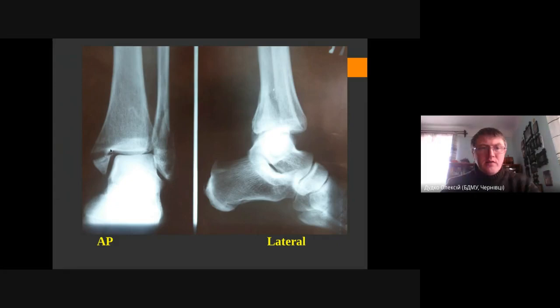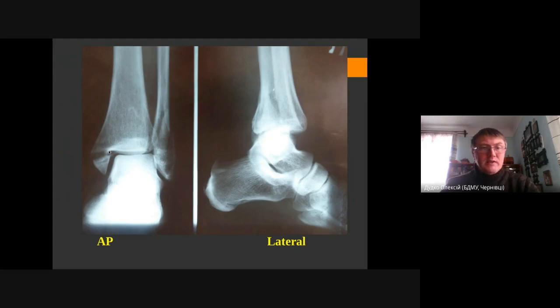We can see the talus is shifted to the lateral side. Comparing the contour of the medial malleolus, this shift indicates subluxation of the talus. So on this AP view we can see a fracture of the medial malleolus and lateral malleolus with subluxation of the talus bone to the lateral side.